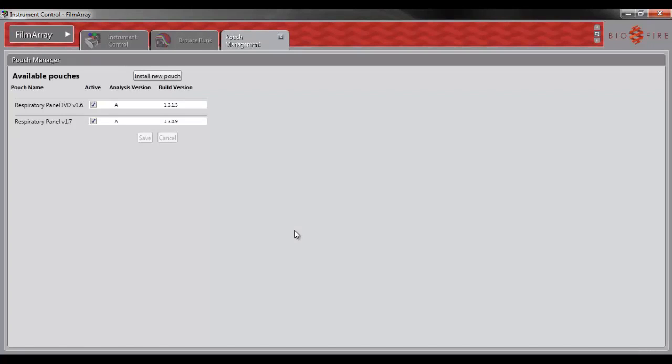As you can see, the pouch module is now displayed and the active box is checked. This means that the pouch module has successfully been loaded.